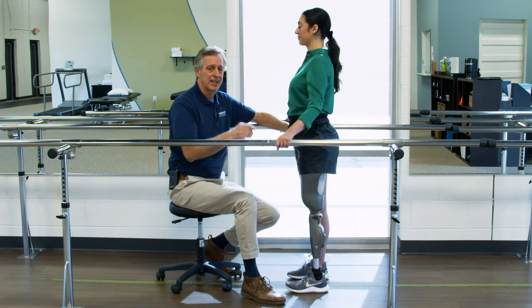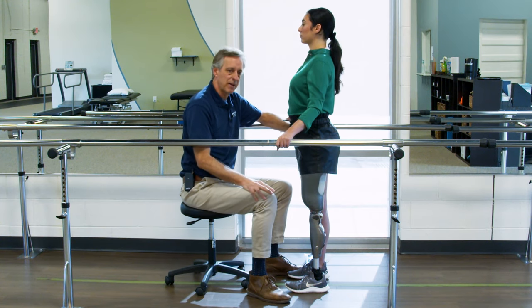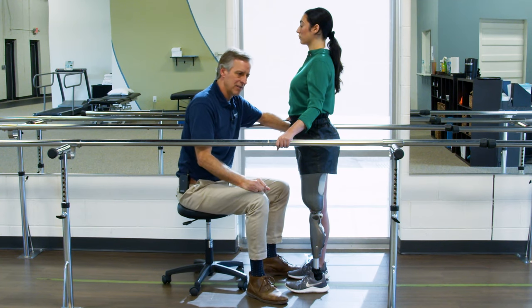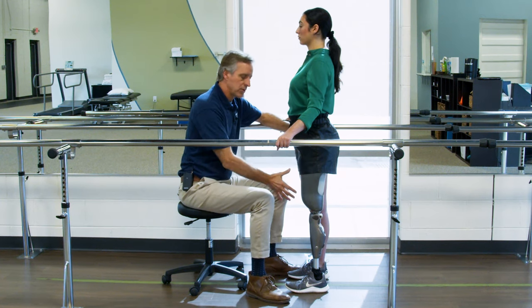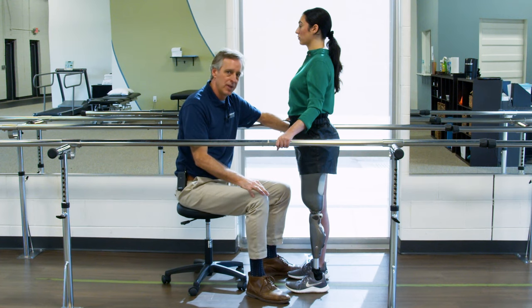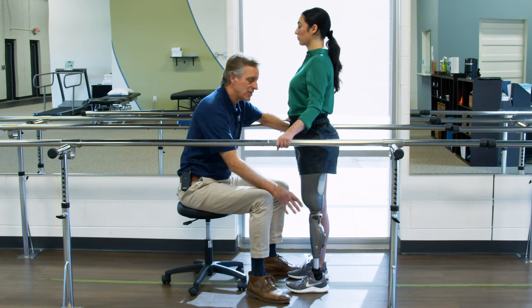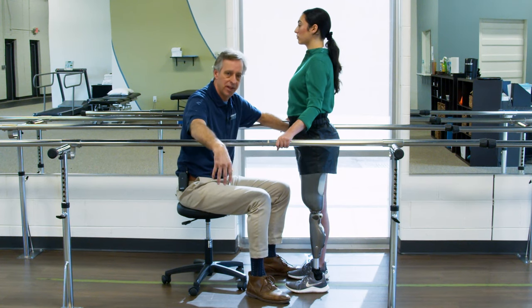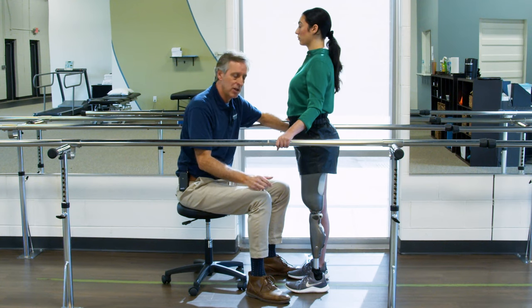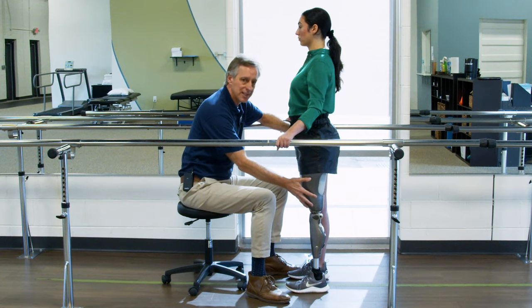We start from a position of finding neutral, but now we have to look into stepping. A common question is: do I learn to step with my prosthetic first or my non-prosthetic first? I tend to teach stepping first with the non-prosthetic leg, because we always want to establish stance before swing. We want to load the prosthetic so you get the technology's energy back. If you just carry the prosthetic forward, you repeat that pattern. What we want is to load it, get the energy back, and let it carry a lot of its own weight.